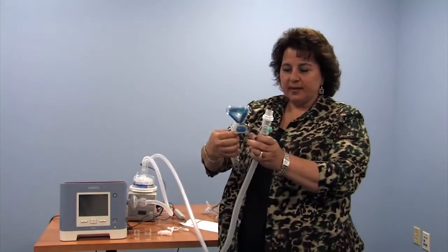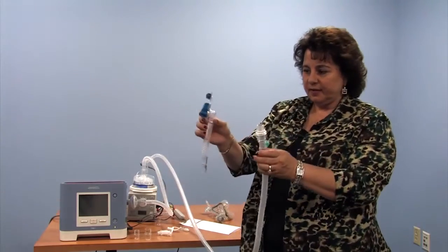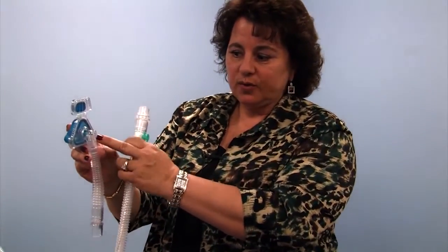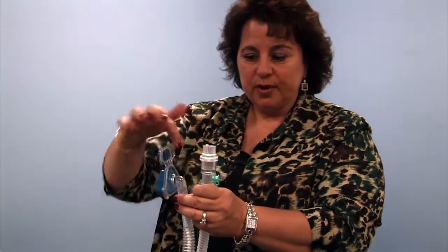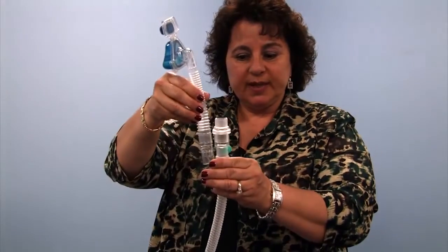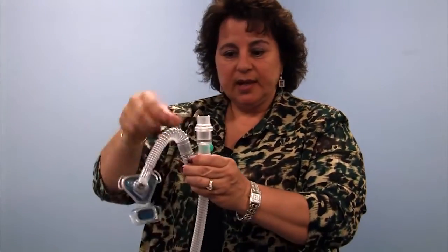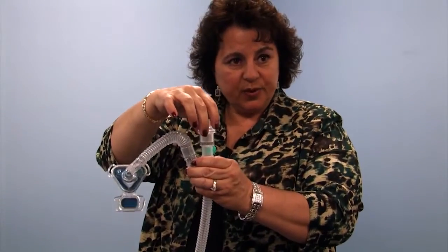This is another mask, a nasal mask for an infant. This has exhalation right here and holes in the mask, so the patient's carbon dioxide will be flushed out through these holes. This could again be directly hooked up to a circuit from the machine. It would not need the secondary whisper swivel.